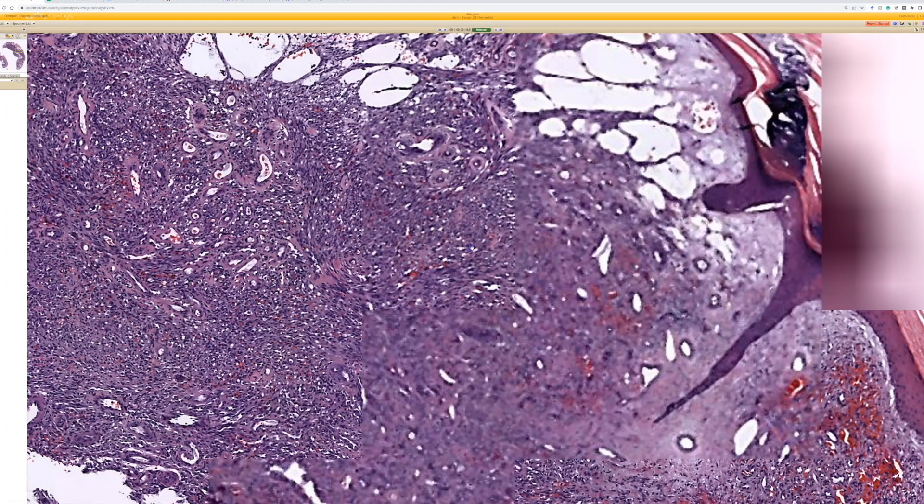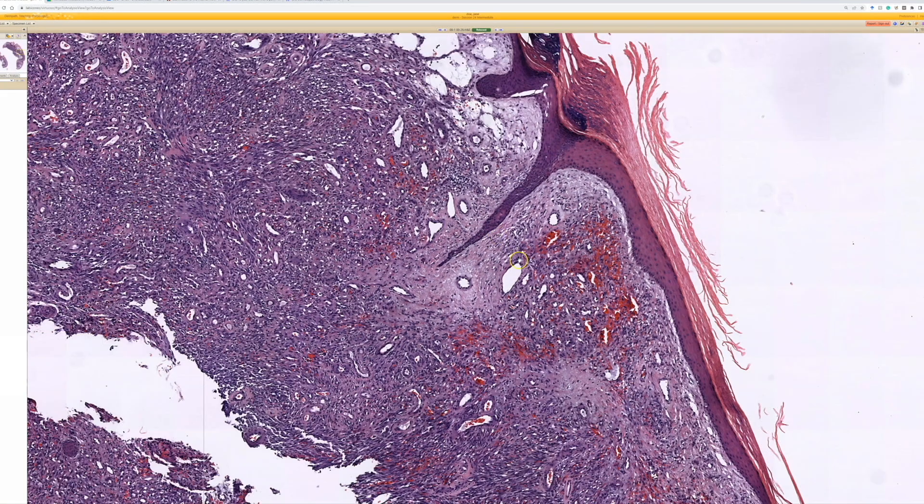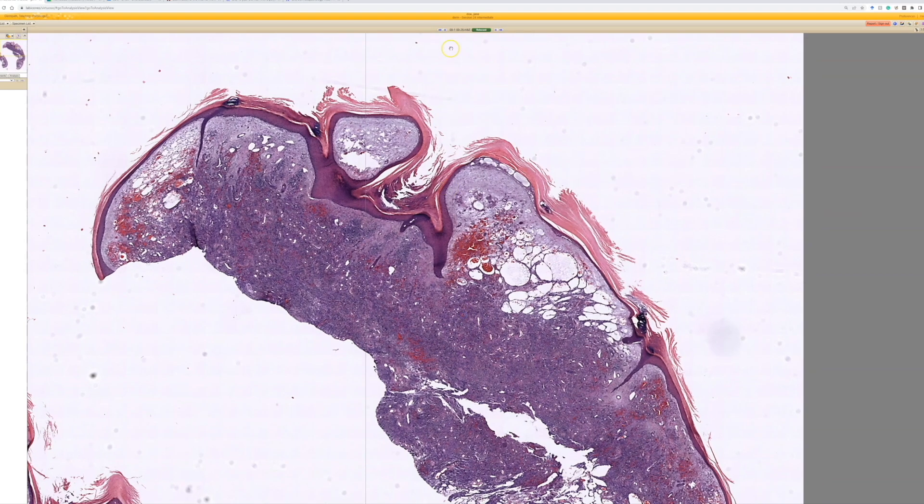There will usually be plasma cells as well. If you have any doubt, you can do the HHV8 stain, which is a really nice stain that's very sensitive and specific to confirm the diagnosis. This is tumor stage Kaposi's sarcoma, and I have a long video about Kaposi's sarcoma — I'll put a link to it down below.